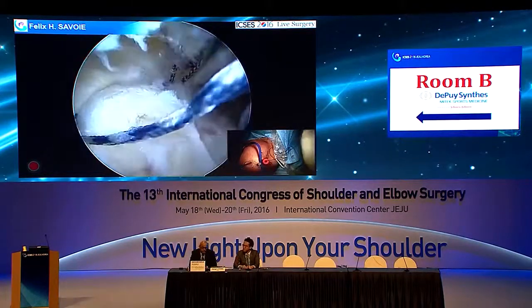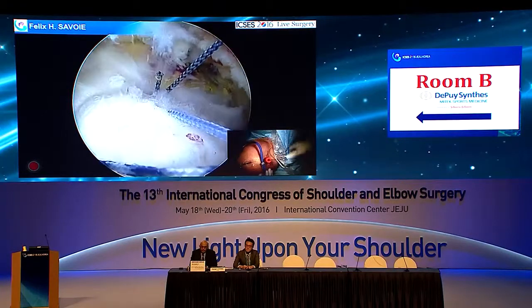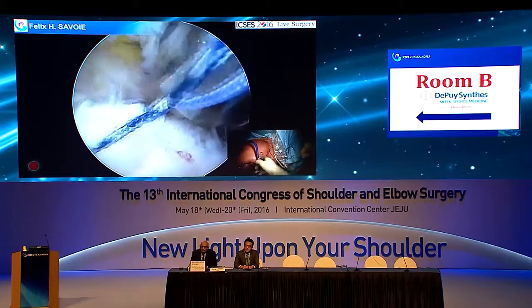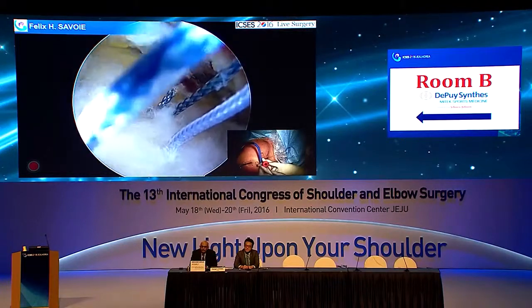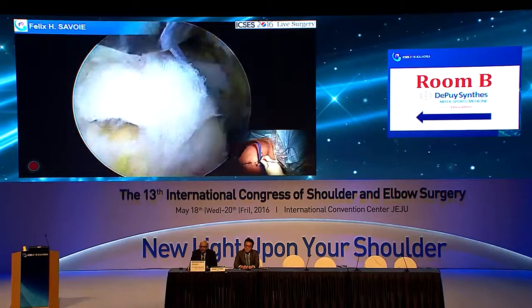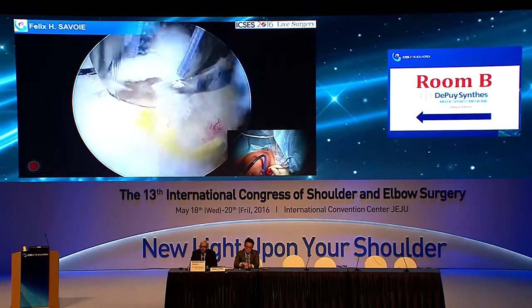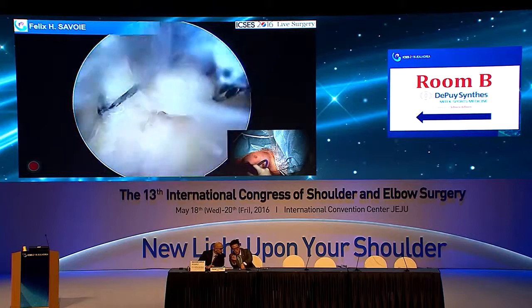Yeah, see? Can you hold these for a second so I don't tangle them? What I did is I passed it so I can use that other one to make another stitch. And now we'll pass all these around. So then they're all sitting up here. Then we've got to decide where we want to put our lateral row. It looks like we could put it right here without too much trouble. So I think that's what we'll do. We'll hold those for a second. We'll take the awl. Let's switch places for just a minute.